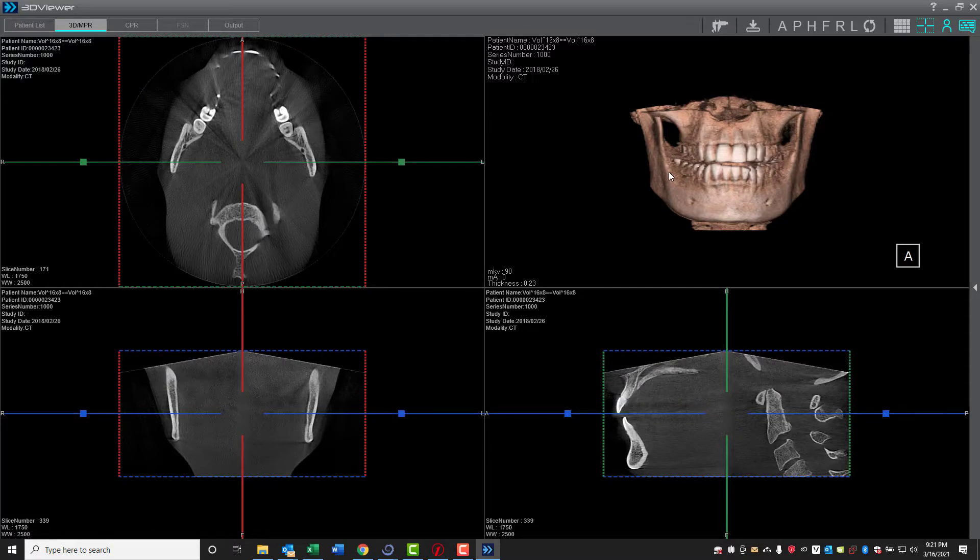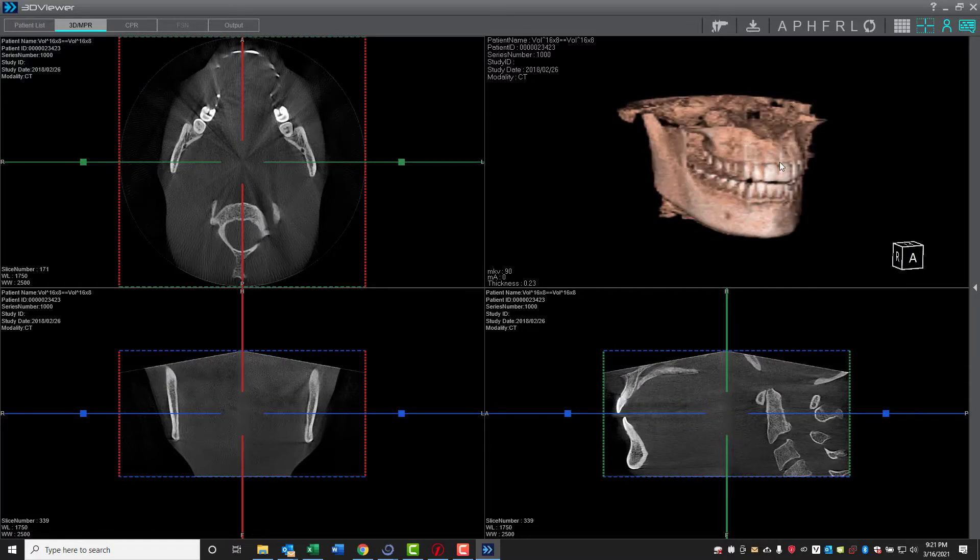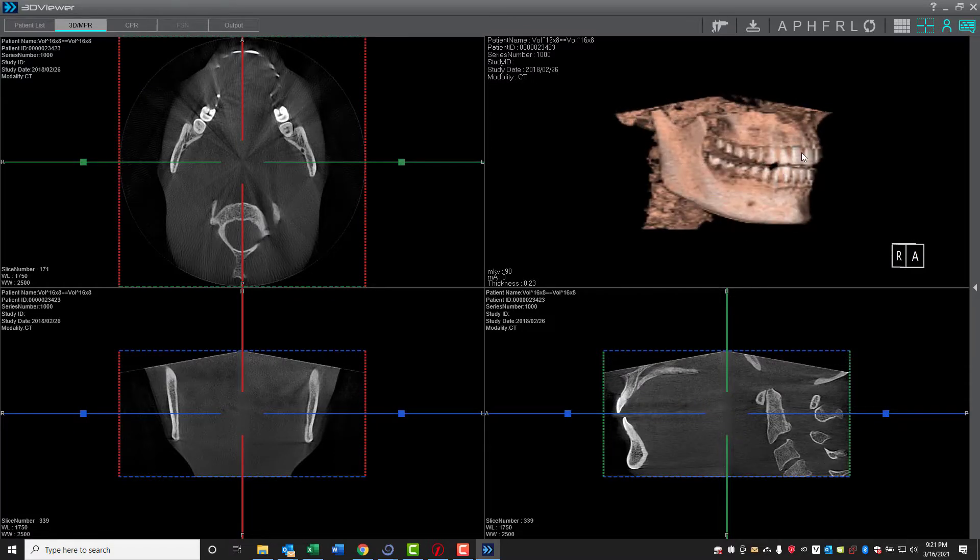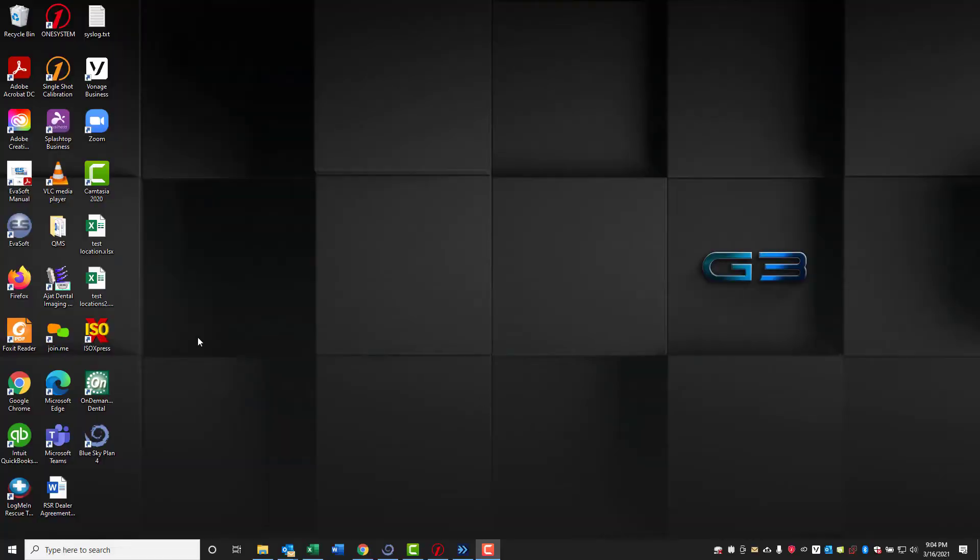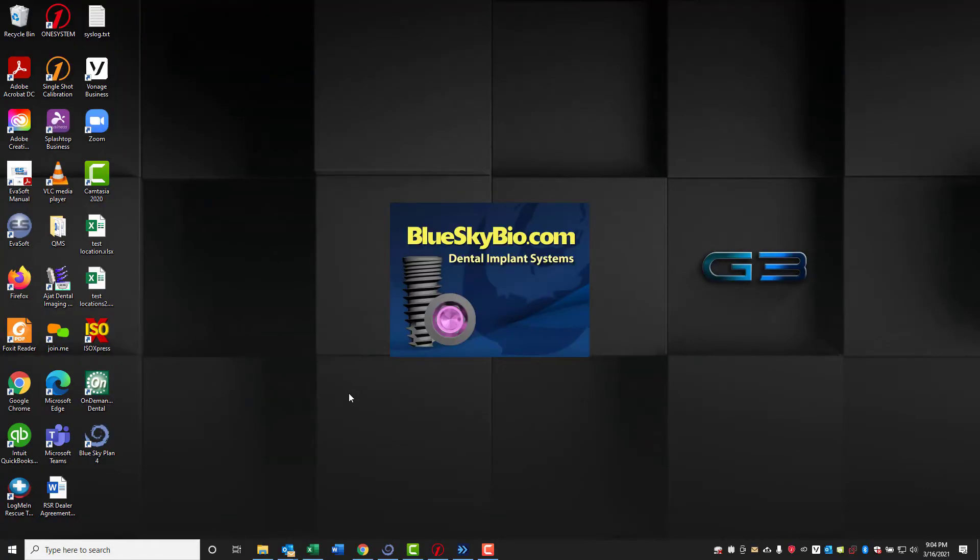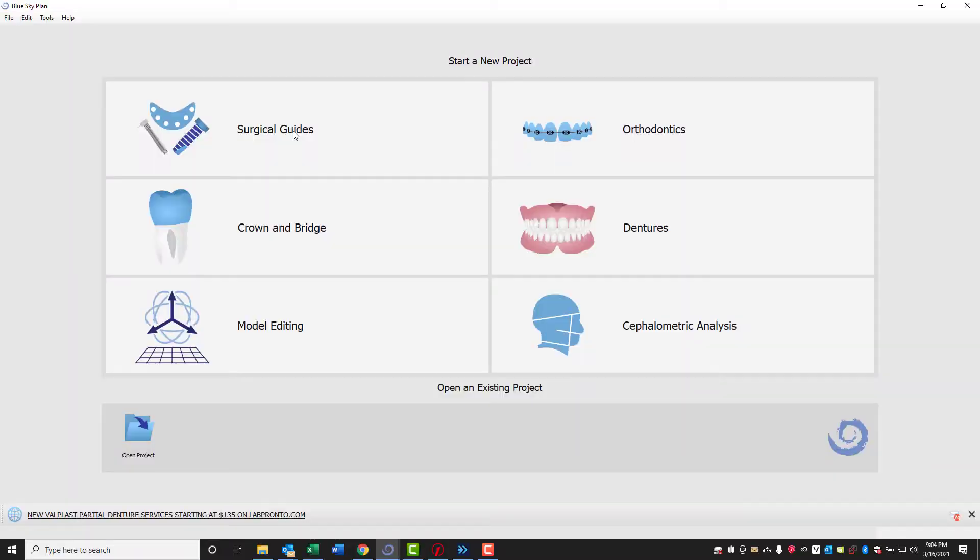We'll start by going into the ImageWorks 3D software just to show the volume that we're going to be importing. Then we'll open up our design software. In this case, we're going to do it with Blue Sky Bio, but it will work with any surgical guide design software that is able to import DICOM scans.